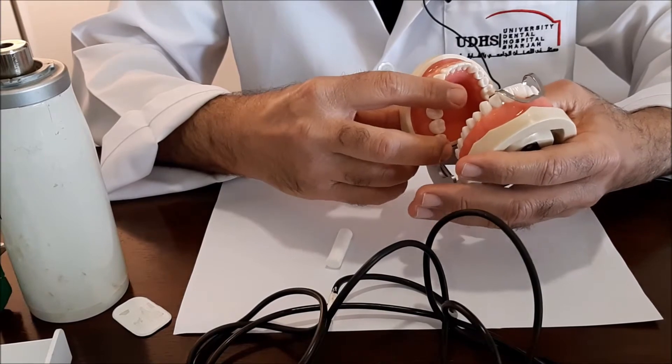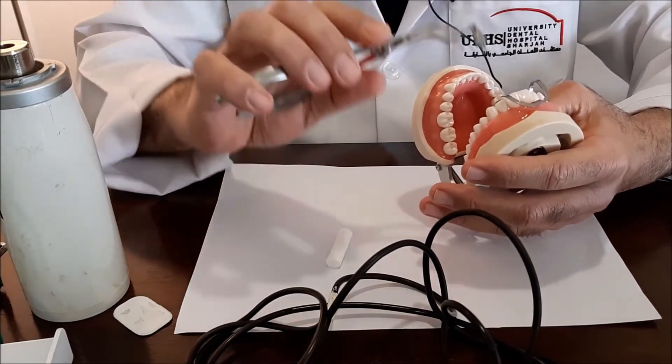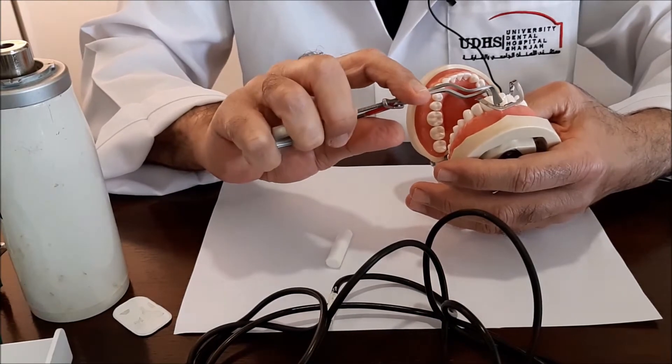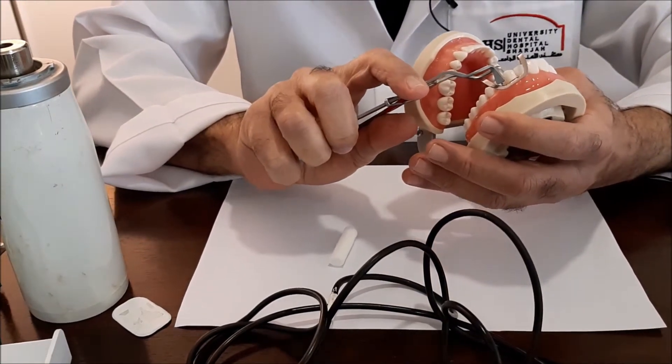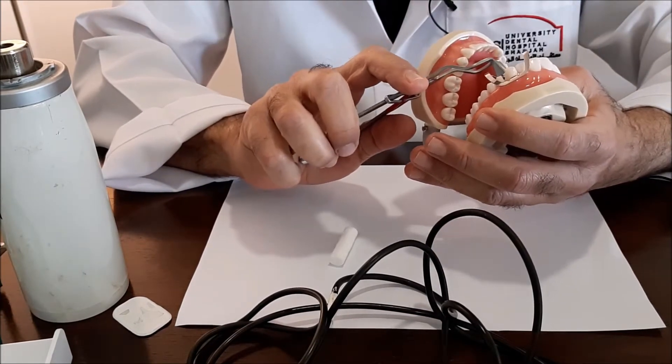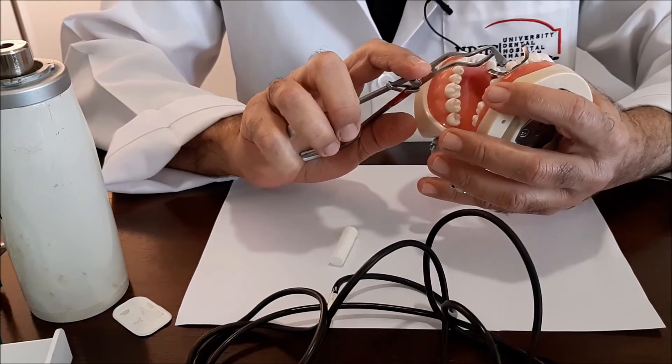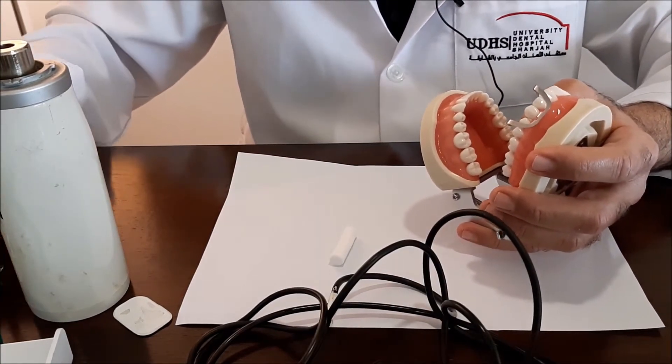When we do a radiograph for the upper canine, the canine actually has a special position and consideration while you're doing a radiograph for the upper canine.